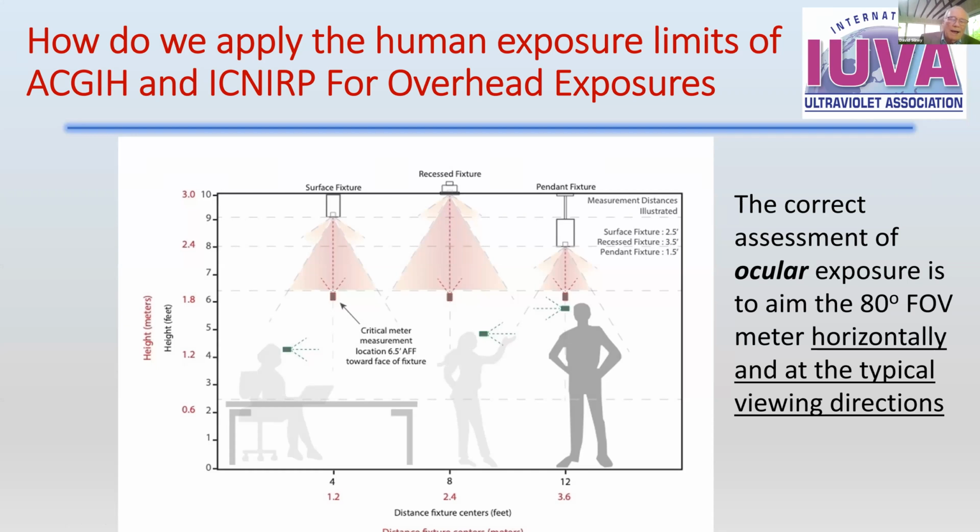So proper application of the standard would help a lot. And unfortunately, there are some efforts to come up with standardized methods to do a safety assessment that don't consider these practical approaches. Hopefully that will be corrected with the publication expected in the next month or two by the Illuminating Engineering Society, the recommended practice for use of germicidal radiation. And I'll end simply by saying there are lots of references here, but I put them on here simply so that we can refer to them later.